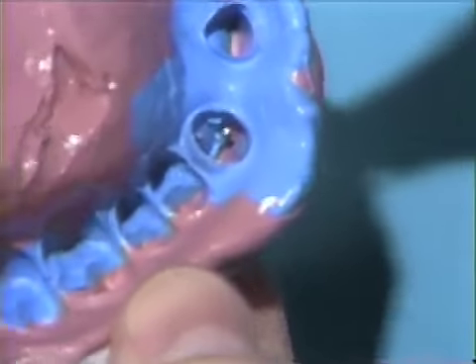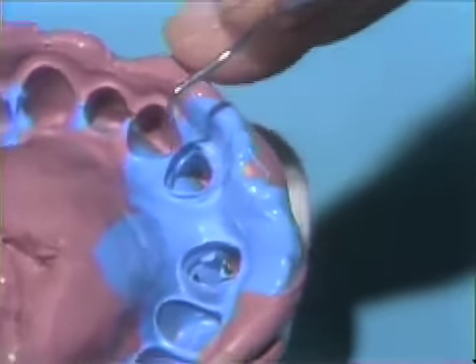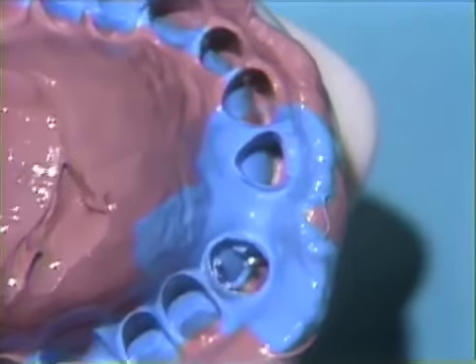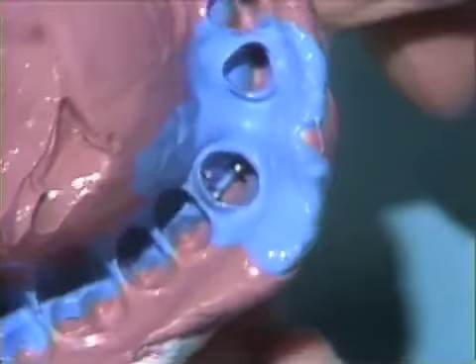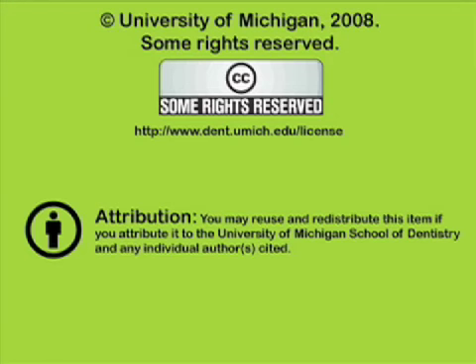We can go over to our porcelain fused to metal restoration and see we also have the margin all the way around this. And on the cingulum area, we also have that cervical margin. This impression is then ready to send to the lab to have it silver plated. We'll mark the tray with our bench number and it's ready to send out.